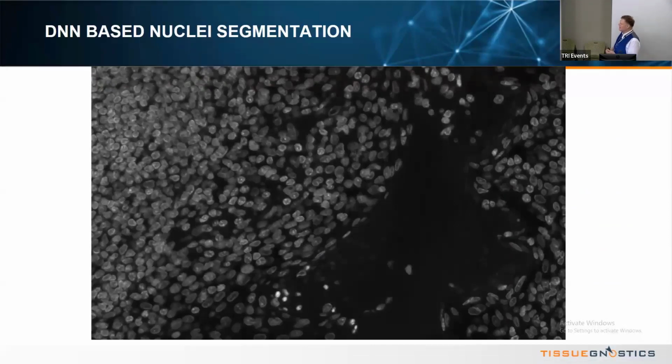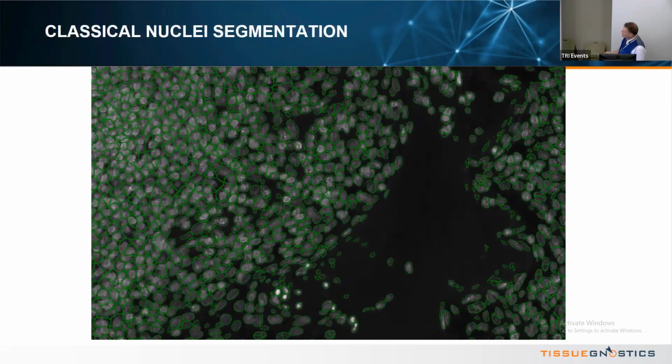a simple example that we experienced a number of years ago. We always had a classical nuclear segmentation algorithm that we used to identify the individual nuclei. In this case, it's a DAPI staining. This worked very well when the cell density was like here. But when the cells became very dense, we ran into problems, because cells were overlapping. Here the recognition is pretty okay, it's very nice. But in these dense areas, which are typical in lymphatic tissue, for example, it was really problematic.